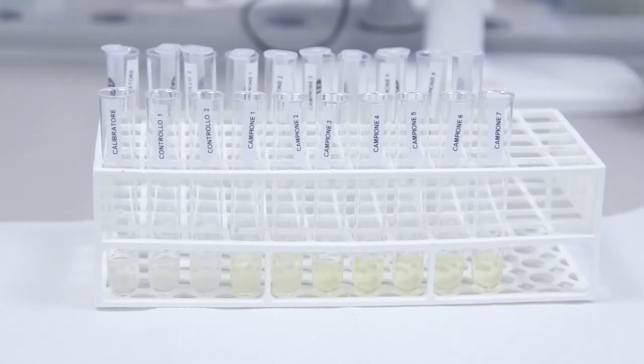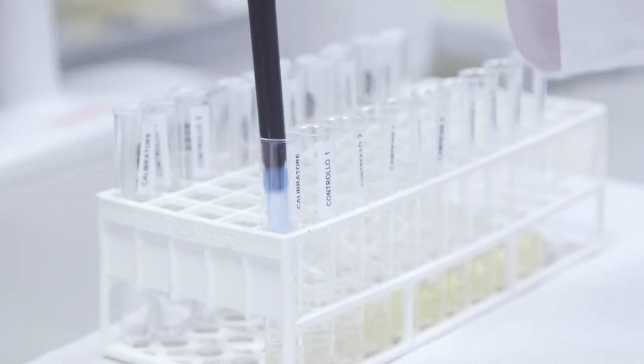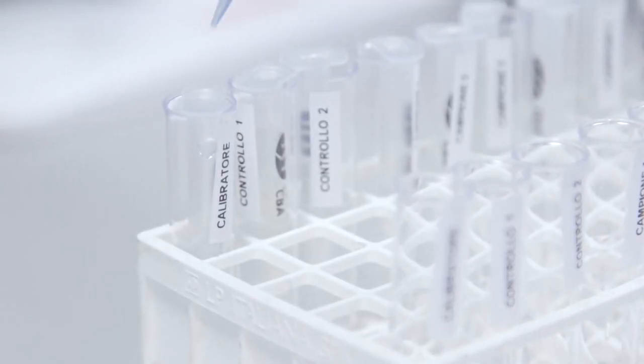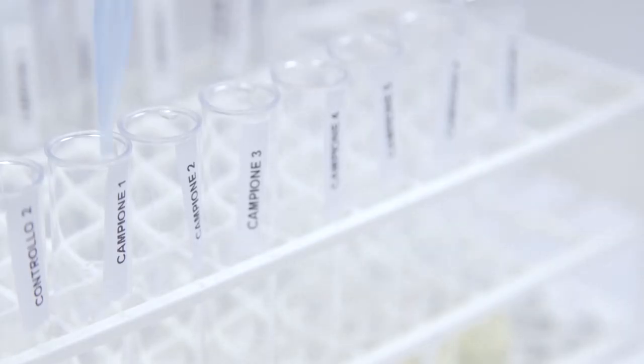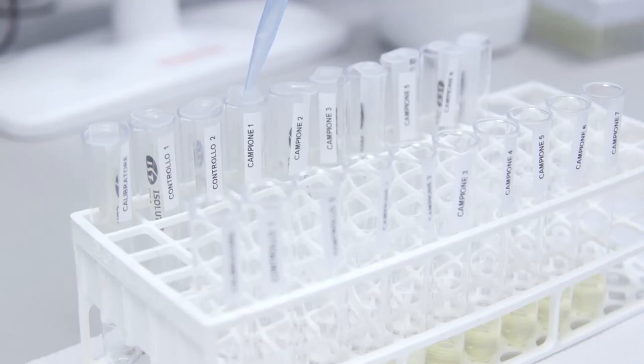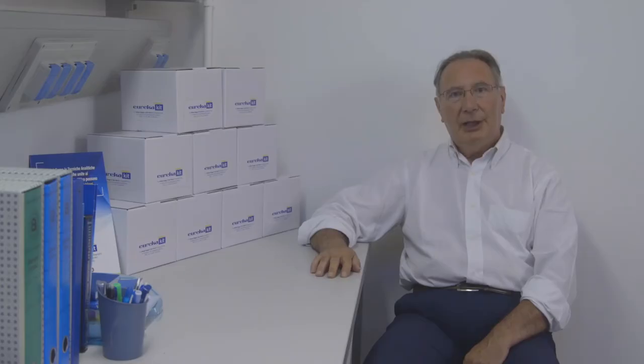Now we add to the SPE column already conditioned, in two consecutive aliquots of one milliliter, the calibrator, the samples, and the controls prepared in the previous step. Let it slowly percolate to the flow of about one milliliter per minute. In this passage the liquid must pass through the column very slowly to make the molecules of interest interact with the resin and remain connected.